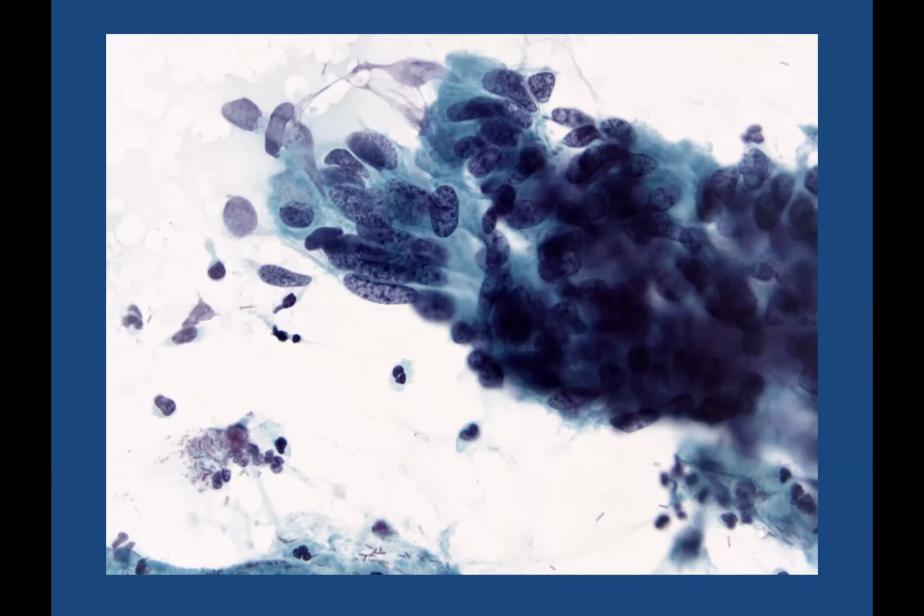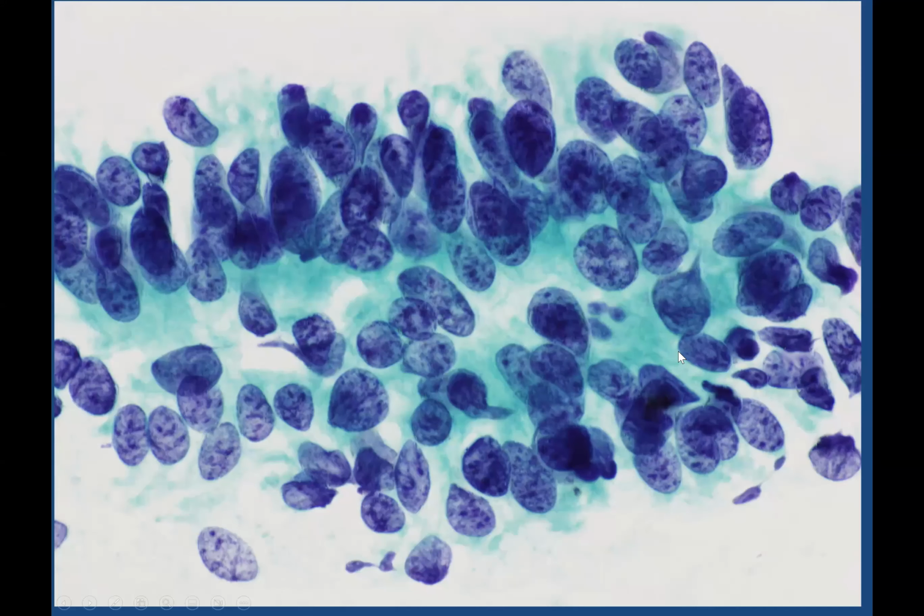That feathering is seen much better here, where you can see these lovely elongate abnormal nuclei, this grainy chromatin, and this irregular feathered edge. This is another example of high-grade CGIN, and there's a number of things to see here. First of all, the chromatin. This is abnormal chromatin. It's too coarse and granular.